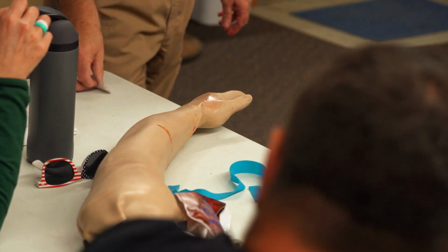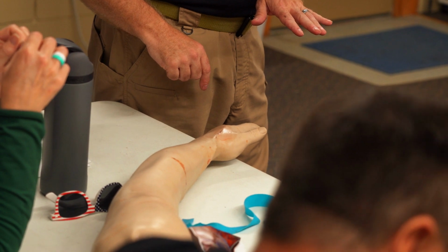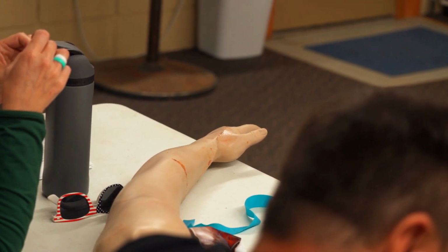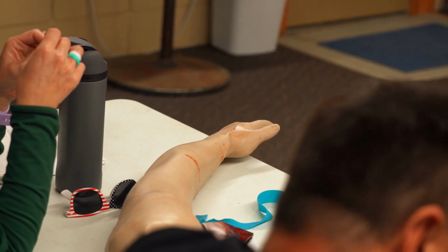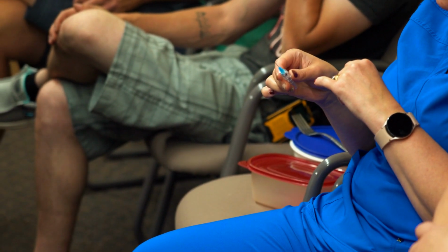Okay, so the idea being that one hasn't been sprung. That's the one you let me open. So what size is that one? Sure, I can open it. You can open the cath, take the cath off. Don't push the white button because that'll retract the needle. Okay, I see the right button now. But now you broke the sterility of it.